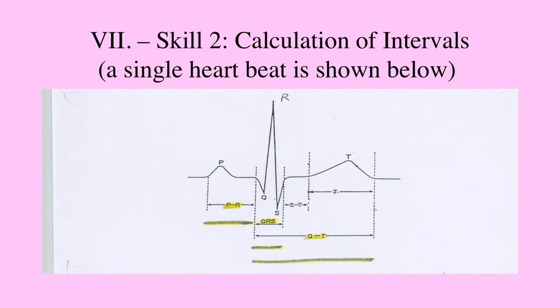The QRS complex could start with a Q wave, but sometimes the Q wave is absent. And if a Q wave is absent, you just go right to where the R wave starts. So it's whatever part of the QRS complex starts is what ends the PR interval, as shown on that slide. And then you can also see that on page 1 in the course pack too.